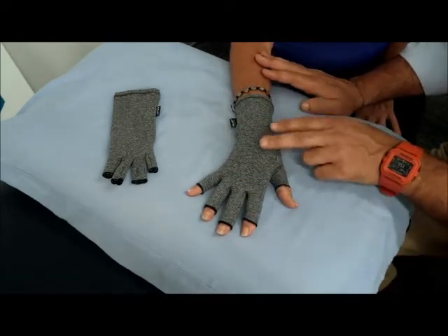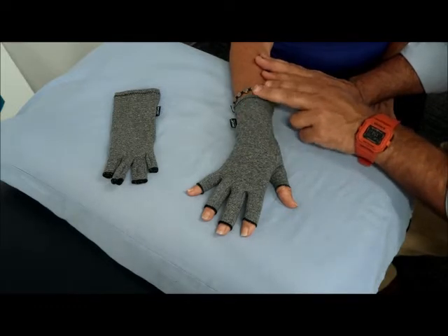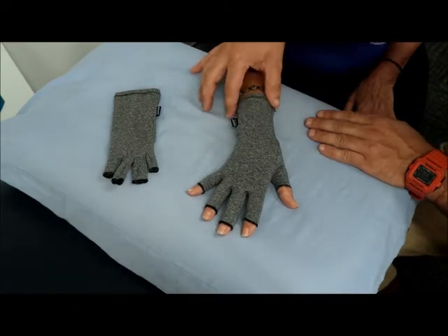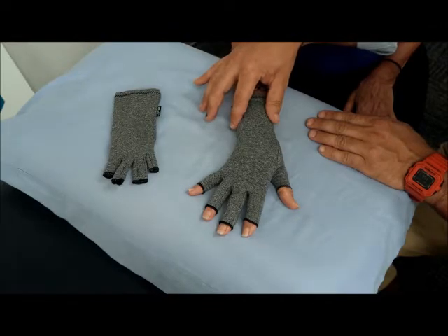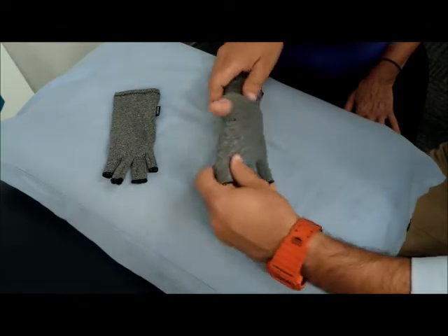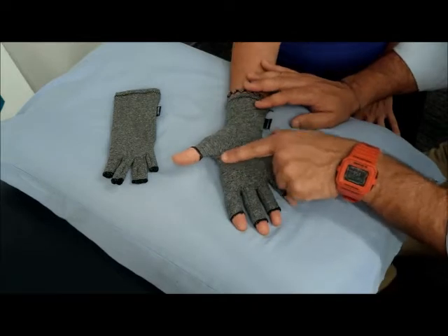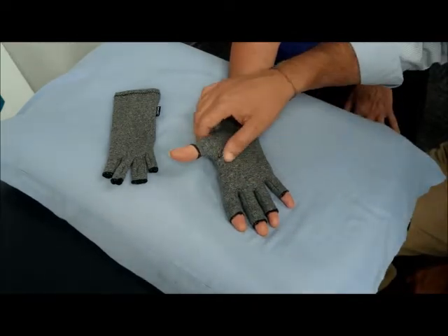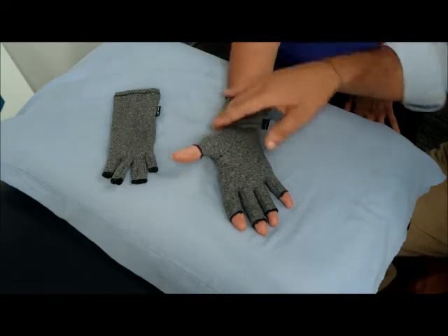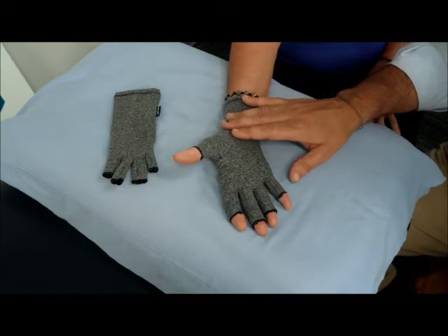The glove goes all the way up past the wrist, coming to the top of the hand, and again it's giving some support and compression at your wrist. If we turn the glove over, you can see there's a seam along here where it's articulated, giving you that compression all the way around your thumb joints — and that's a place that lots of people feel a lot of pain and discomfort.